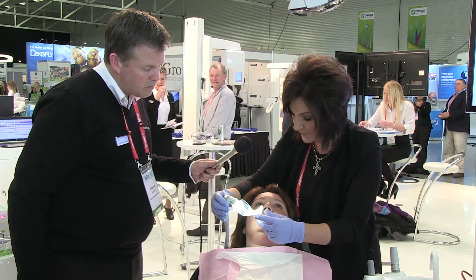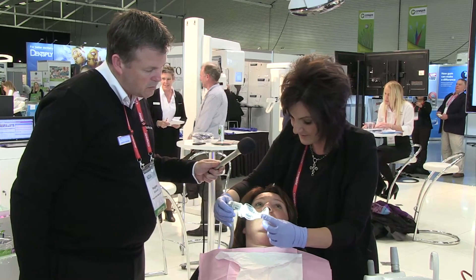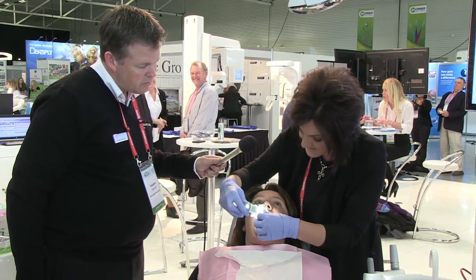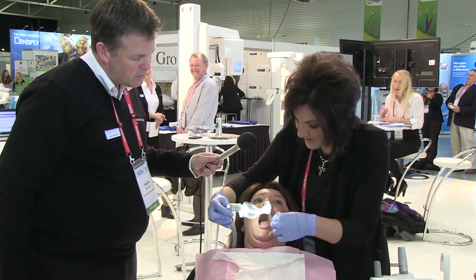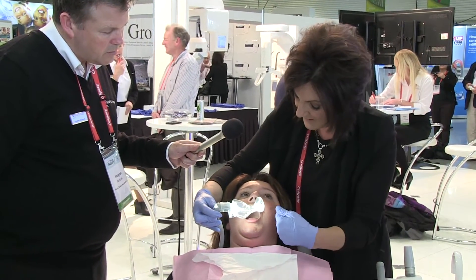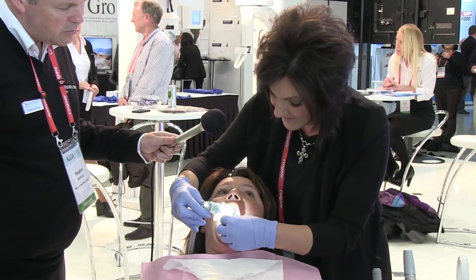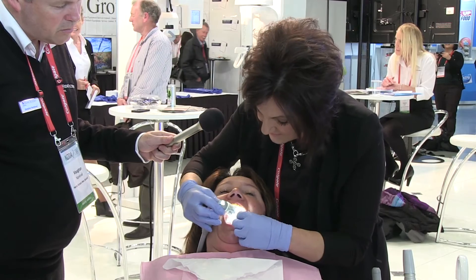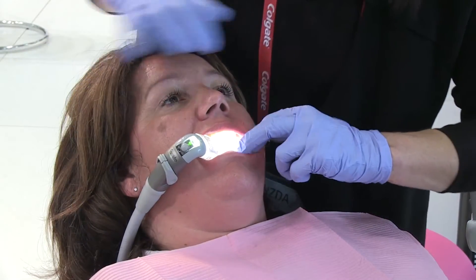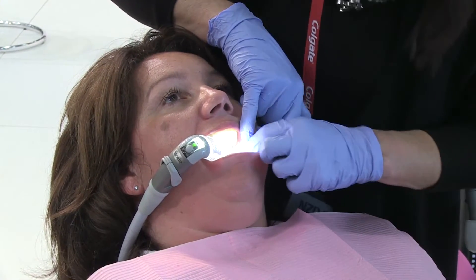The mouthpiece is about a 40-shore polymer, so it's very pliable and soft. It meets gingival resistance really nicely in the mouth. We fold at the isthmus — I insert the whale tail, as it's known, into the buccal sulcus of the opposing quadrant I want to sit it in. I fold it, insert it, and place it back onto the occlusal surface of the molars on the opposing quadrant, tucking it into place.